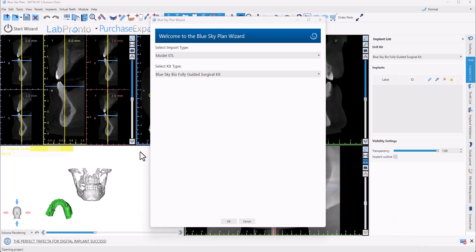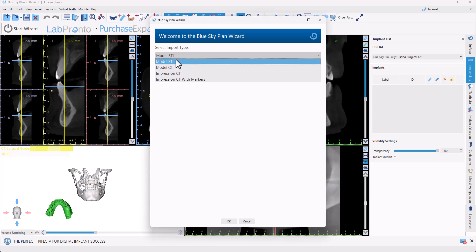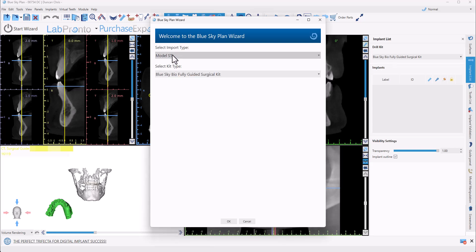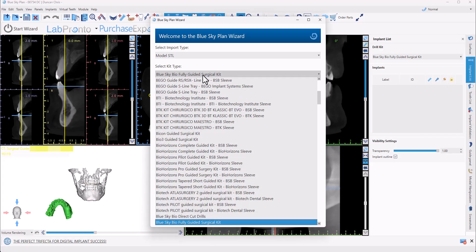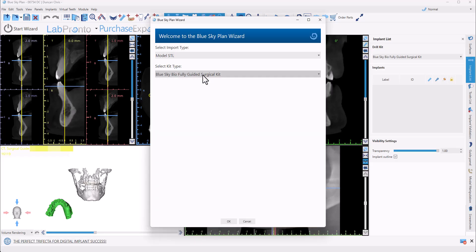The software is now importing the relevant data. We're being prompted to select the import type — in most situations it's Model STL as we have selected — and the kit type: Blue Sky Bio Fully Guided Surgical Kit. Blue Sky Bio has more than 80 different implant systems loaded into the software, so if you are using a different implant system, go ahead and select the relevant kit. Once you've confirmed the selection, click OK to start the wizard process.